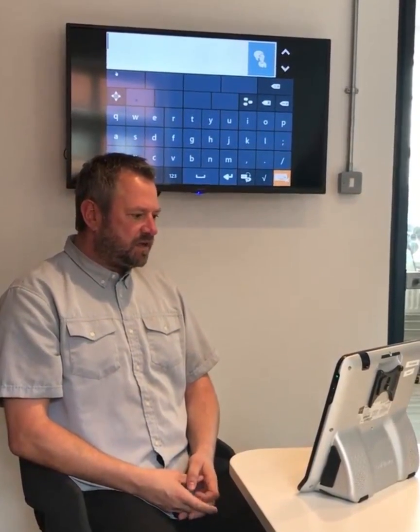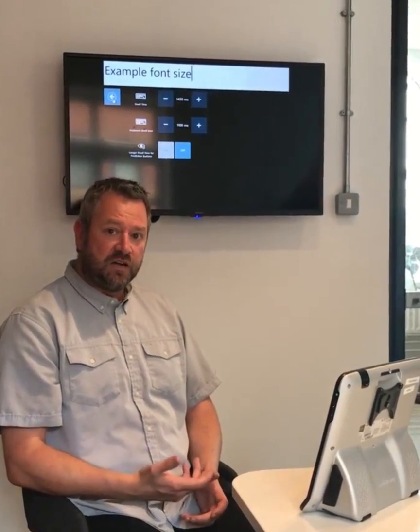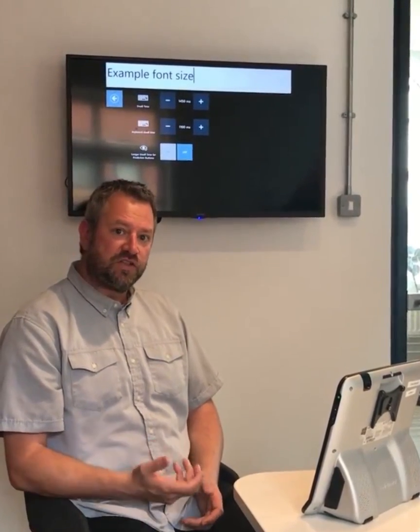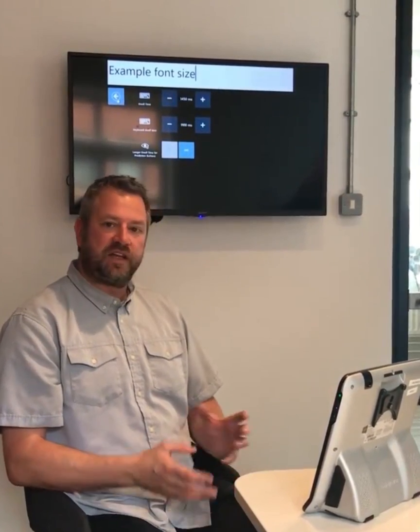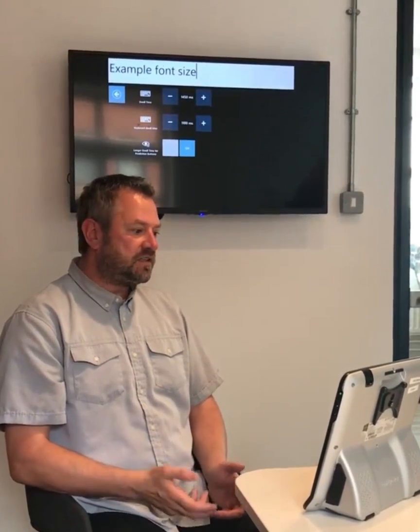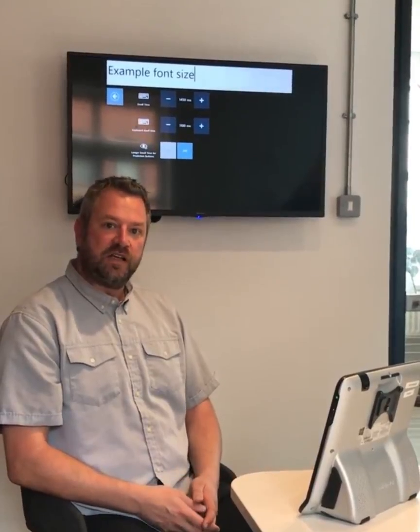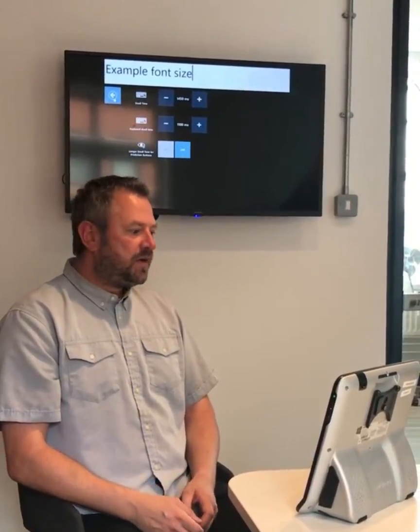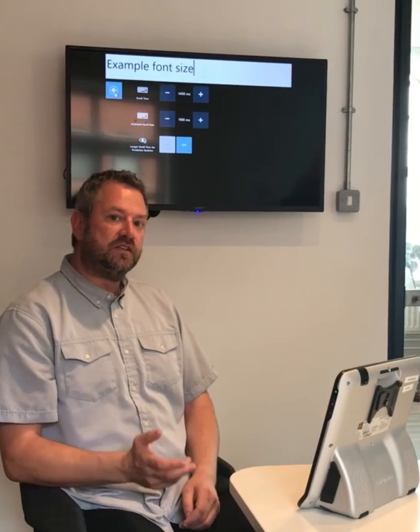So I can come into my settings on my keyboard and click on dwell time. What you see now is that I've got two different dwell times. The top dwell time is my navigation dwell time, and that's currently set to 1,450 milliseconds. My keyboard dwell time is set to 1,100 milliseconds.